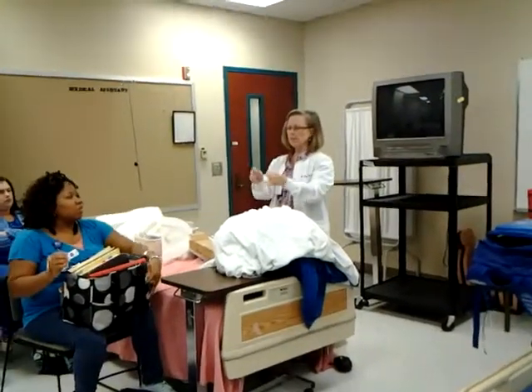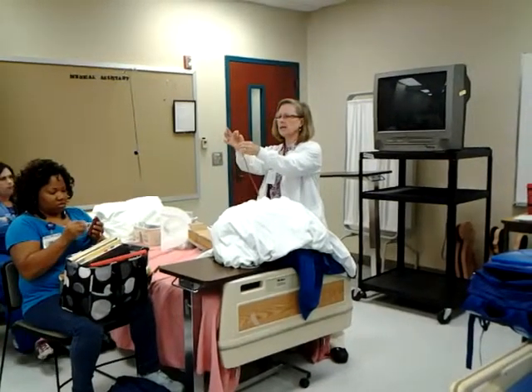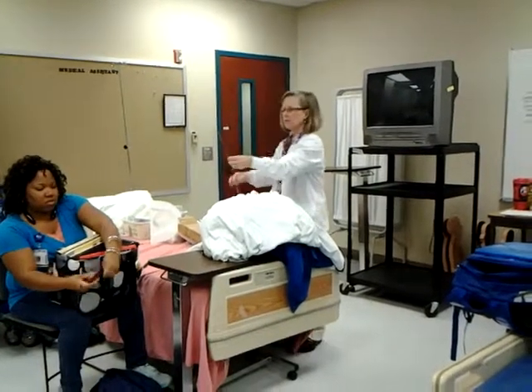I'm going to pass this around. This is red rubber and it's more rigid than what you normally see. Notice there are holes at the end — not just one, but two holes. So if one gets plugged with mucus or blood, the catheter will still drain.